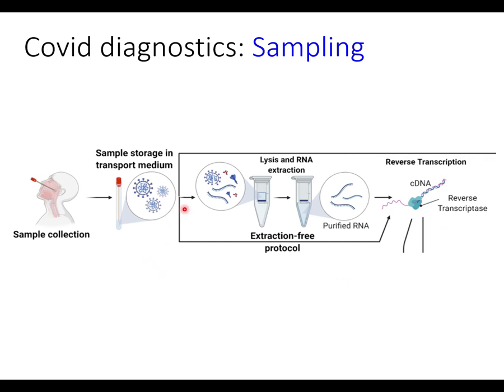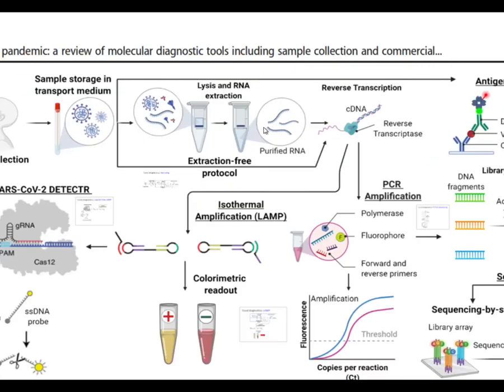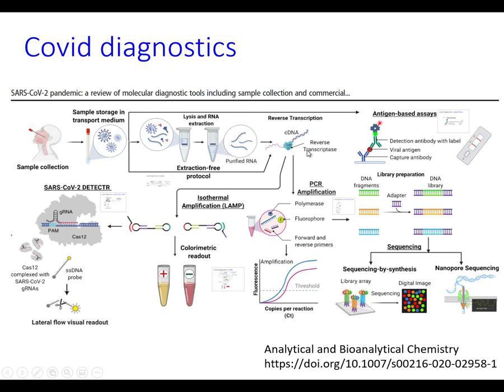What we'll be talking about shortly is the other way that we test these things, through lateral flow assays, and in that case we take our sample stored in our media and take it straight again into an assay which looks at a slightly different thing. So we're going to look at how we then first do things in lateral flow assays.